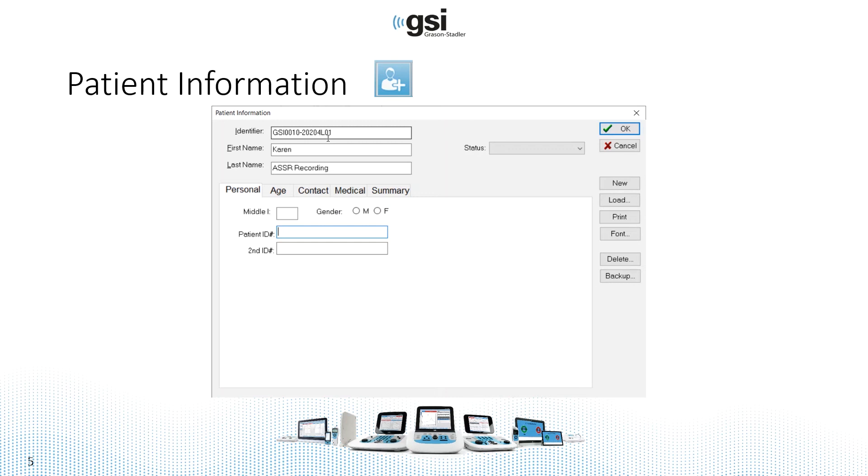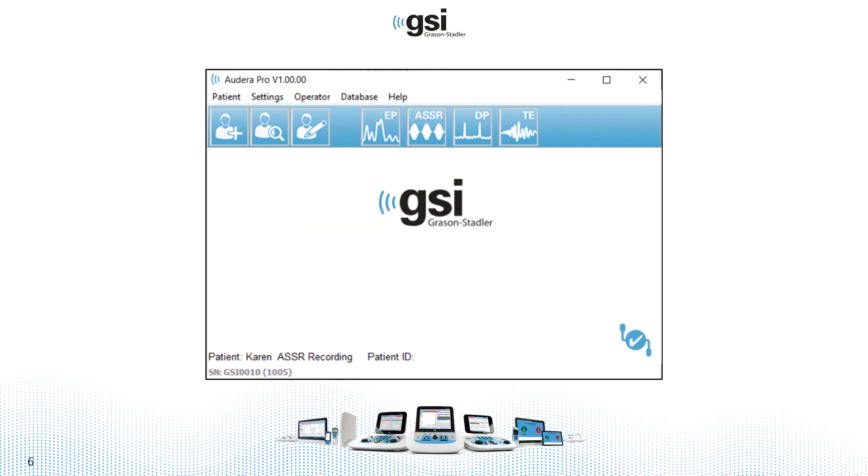The identifier up at the top is automatically assigned, so you only have the two fields, first and last, to fill in. Once you do that, you go back to the main screen and select the test module that you want to run.